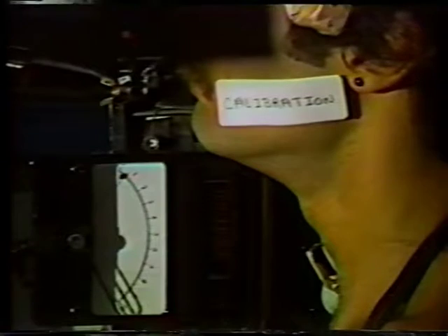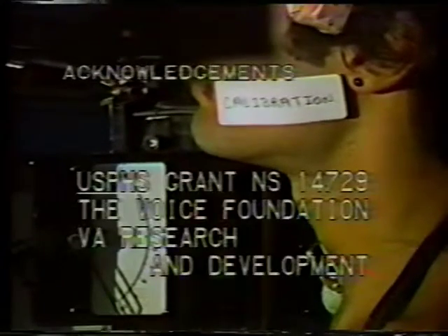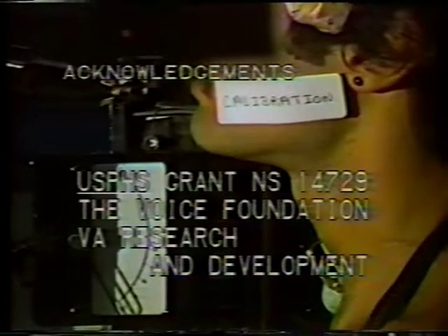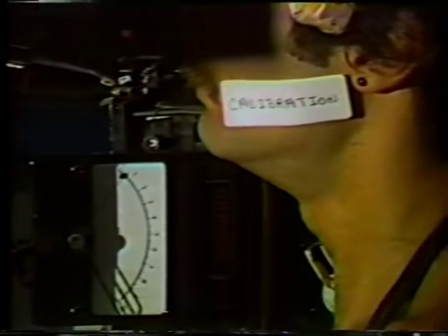For a given electrode insertion, each subject performs a maneuver specifically designed to sample each muscle's EMG activity across its full range. The peak activity for each muscle during this maneuver is integrated and averaged and assigned a value of 100. The baseline noise level for each muscle when quiet is also integrated and averaged and assigned a value of zero. In this manner, any muscle activity during the experimental procedure can be expressed as a percentage of that muscle's contraction for the given electrode insertion. These percentages can then be compared within and between subjects so that statements can be made about populations larger than one.